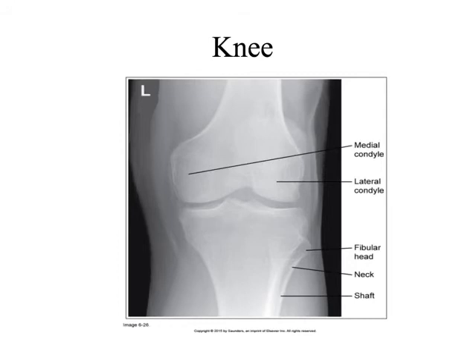What other things have y'all seen? Have y'all seen any little tricks for lateral knees? What helps us get a good lateral knee? A lot of times, like at Campbell, I know they want you to keep that 3 to 5 degree angle on the lateral. Yeah, that angle does help. Open up that space, bring the leg across, and make sure their hips are more perpendicular. Bring the other leg up and over. Is that what you're saying? Yeah, that's helpful.